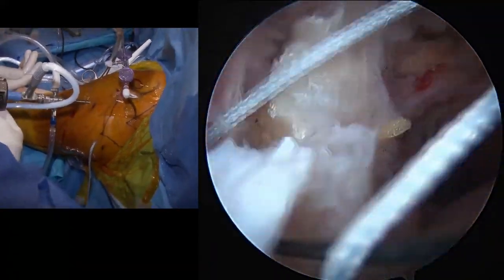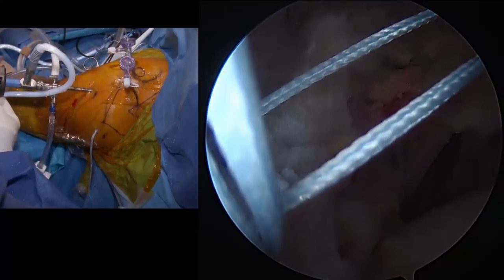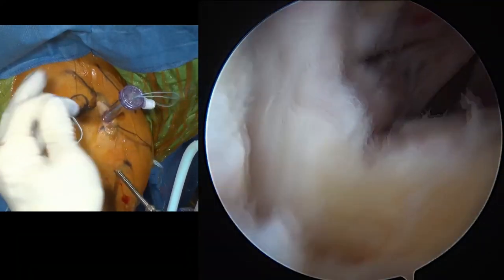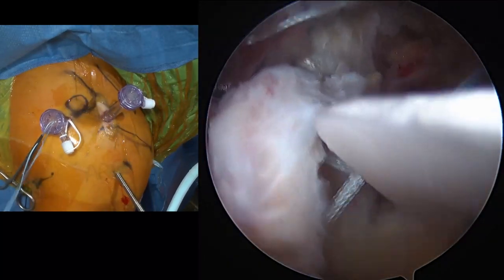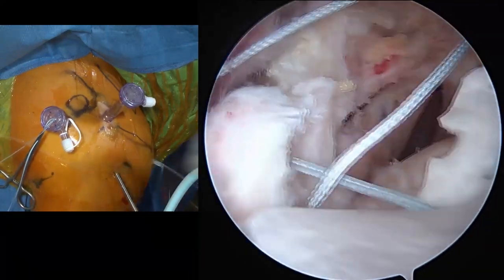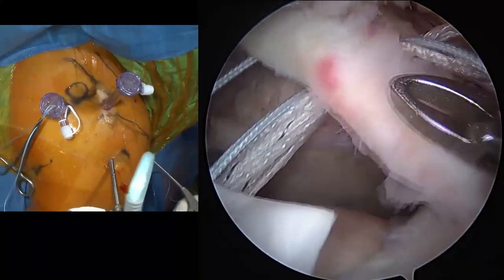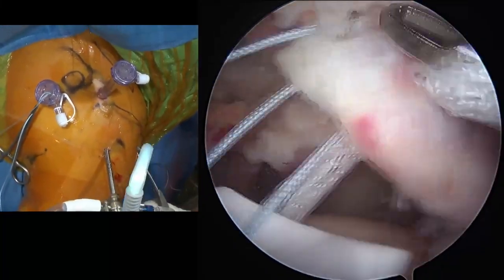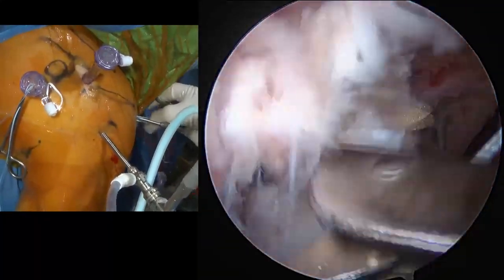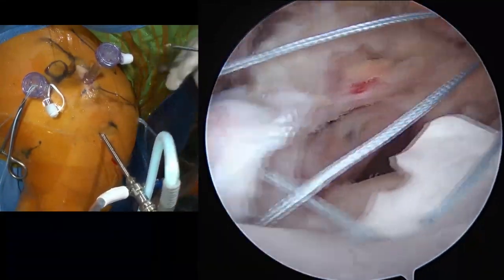We've got to just make sure we don't tangle it up with all our sutures. We're going to put that underneath the other one. Hold this please. Okay. Okay, good. Suture retriever. I think I can leave that alone. I just got to get this other one out of the way.